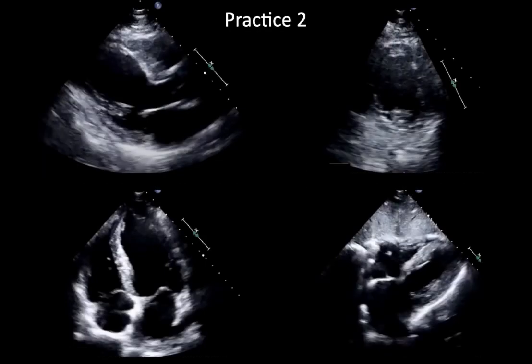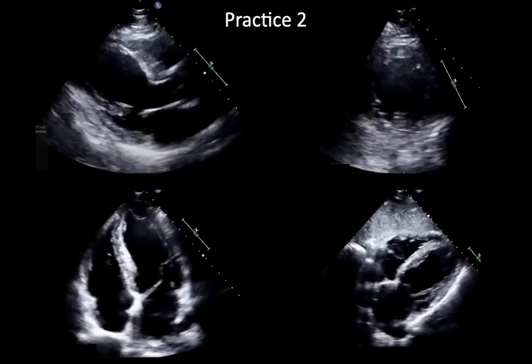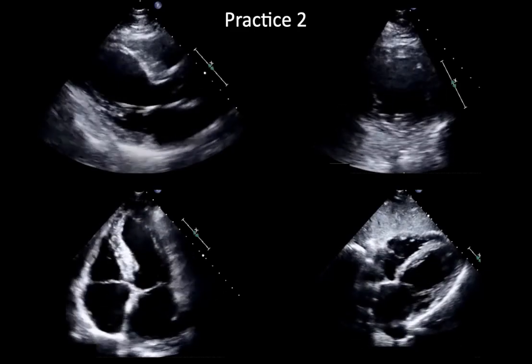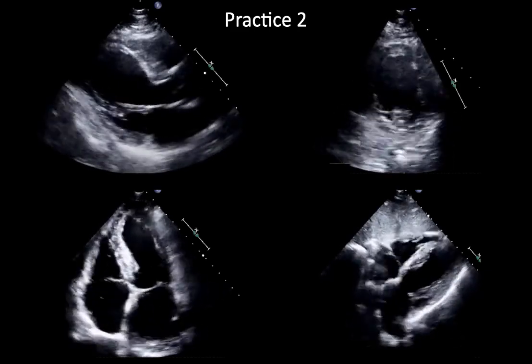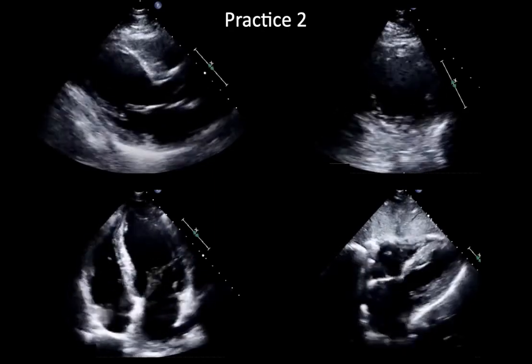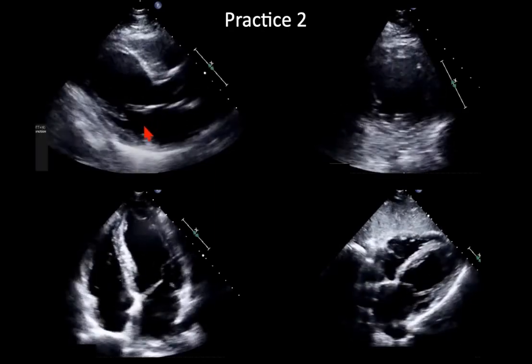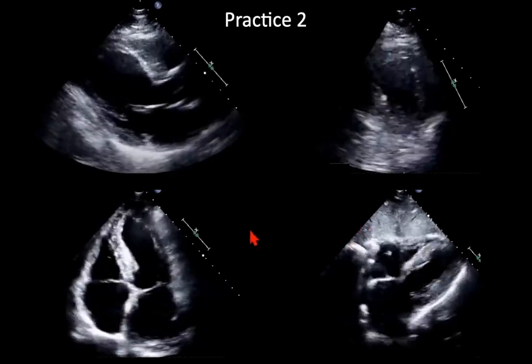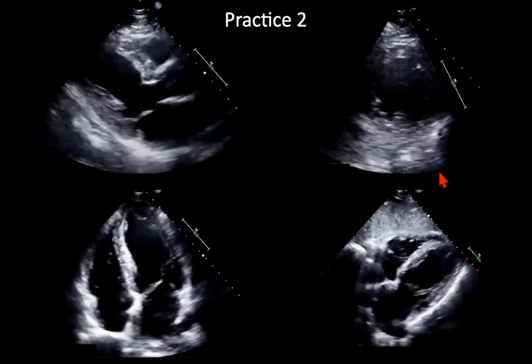Okay, so case number 2. Here we see the heart beating at a slower rate, which sometimes may give us the impression of a weaker contractility. But remember to apply the 4 visual estimation approaches and not let the heart rate distract us. So here in the parasternal long axis view, the anterior leaflet of the mitral valve is touching the septum. Overall, if you look at all the views, muscles show normal thickening and shortening.